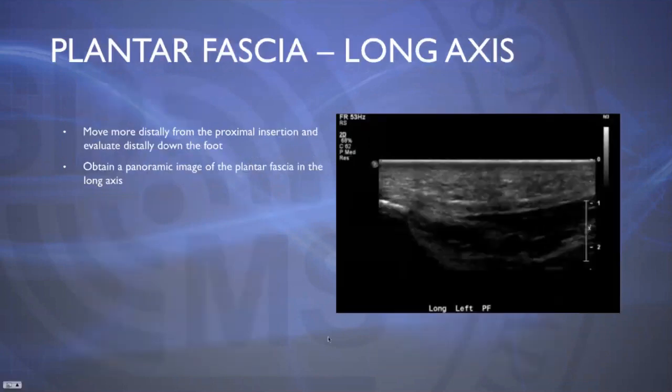As you move more distally from the proximal insertion, you'll want to evaluate distally down the foot, and we can obtain a panoramic image of the entire plantar fascia in the long axis, but this is showing you here more mid into the distal aspect of the plantar fascia.